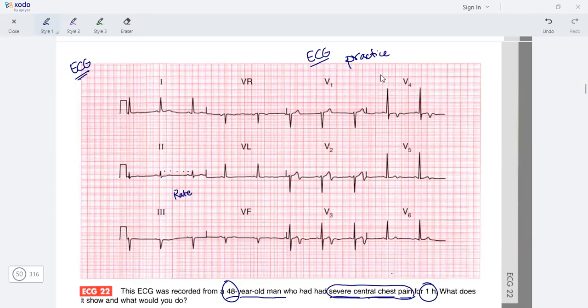Starting with the first ECG, the rate is around 60 beats per minute. The rhythm shows P-R, P-R, P-R consistently, so the rhythm is sinus.